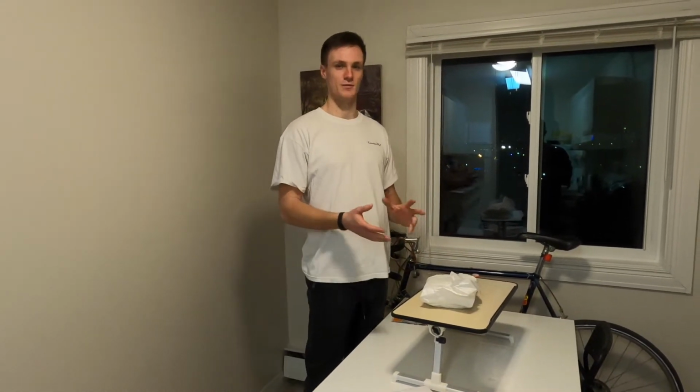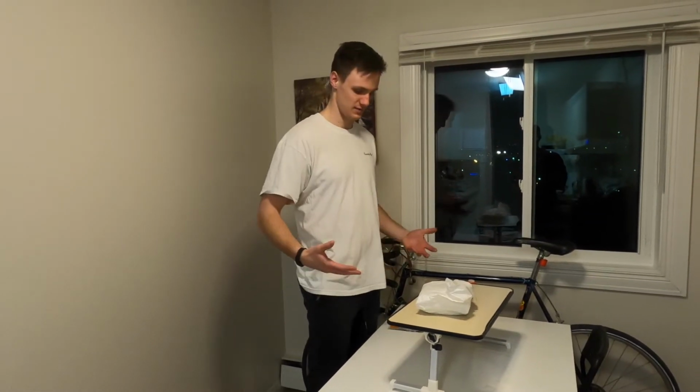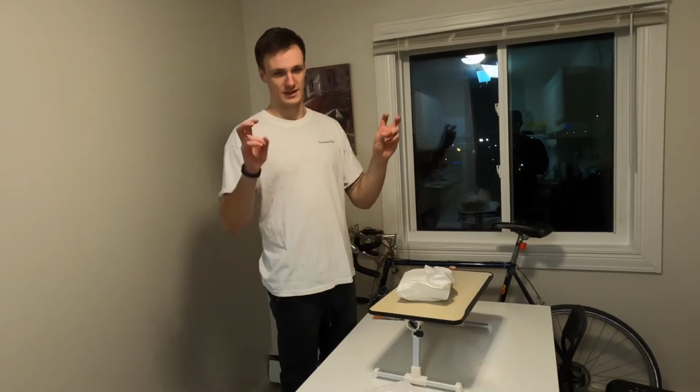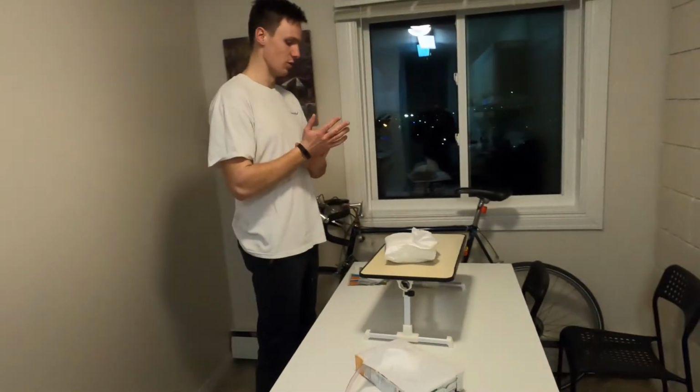Before I get started, I'm just going to mention that my field of work here is below my realm of sterility. In practice, my workspace would be higher above my waist, but since my table is so low, it's going to be below my waist and technically not sterile. So I can get started here.